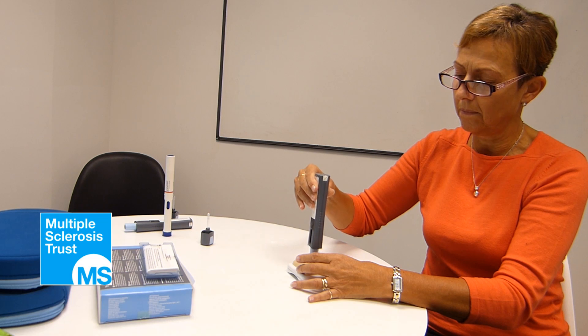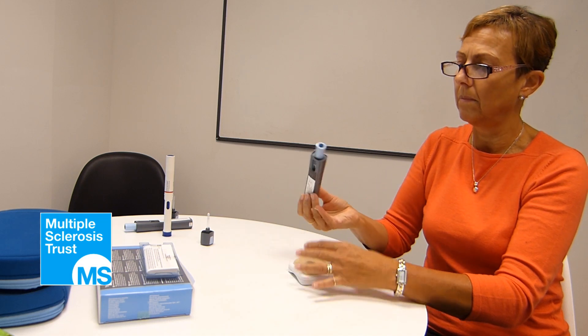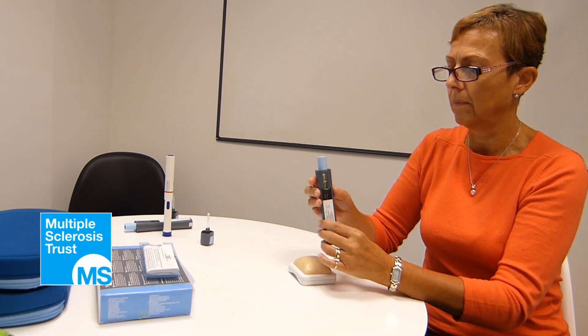Lift the Plegrity pen from the injection site. The needle guard will automatically extend, covering the needle completely. Apply a gauze pad to the injection site if needed.